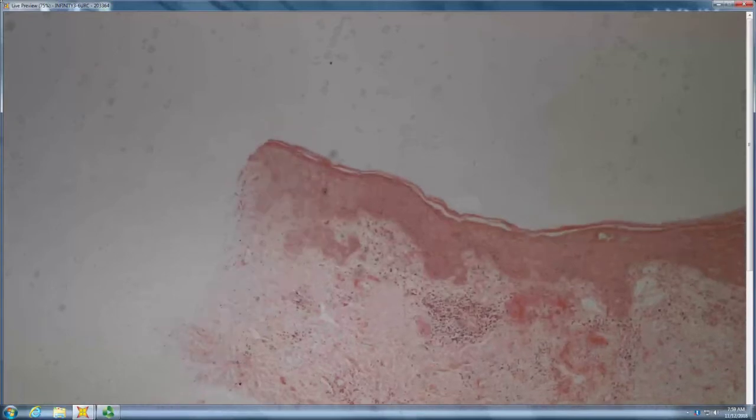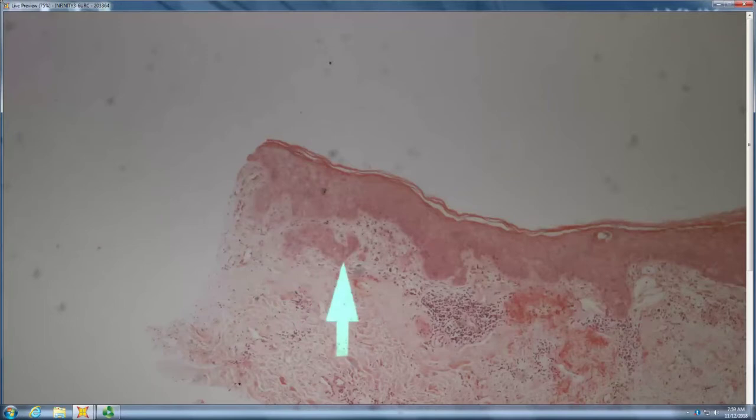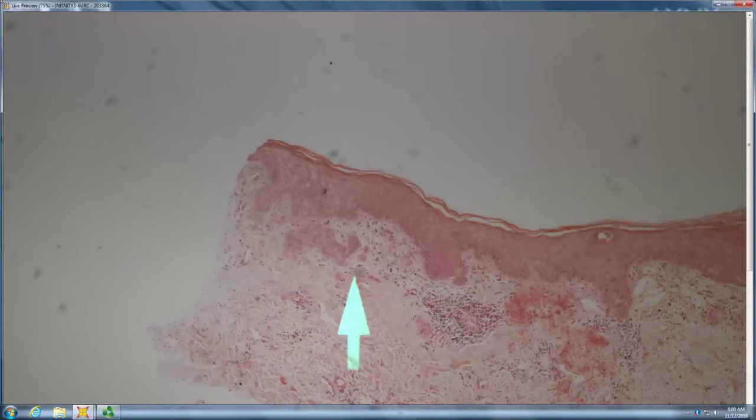And so now, is that squame arising in lupus, or is that hypertrophic lupus? Any way to tell? Because that can be tricky sometimes. Looks like the collagen looks a little looser around it. I don't know if that would be helpful in that area. Plus minus.